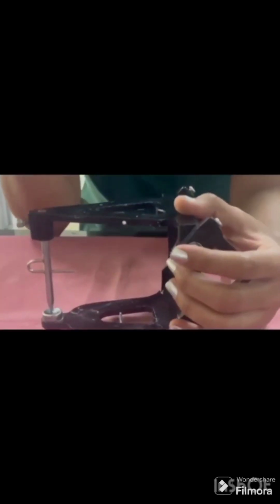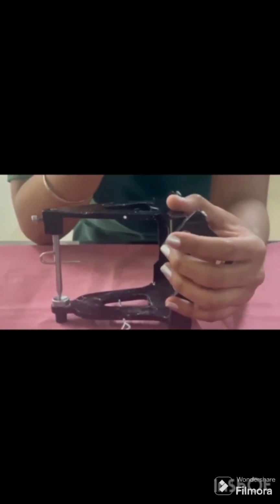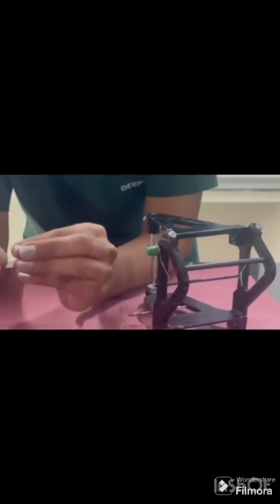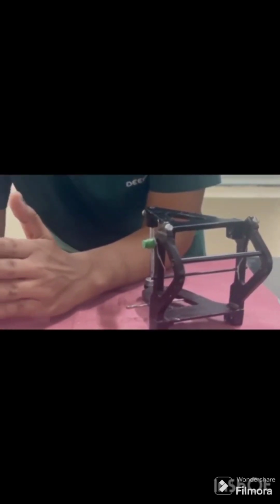Coming to the classification of the articulators, based on adjustability, it is classified as non-adjustable articulator, semi-adjustable articulator and fully adjustable articulator. A non-adjustable articulator does not allow adjustment to replicate any mandibular movements. Examples include class 1 and class 2 articulators. A semi-adjustable articulator allows adjustment to replicate average mandibular movements, which includes class 3 articulators. A fully adjustable articulator allows replication of three-dimensional movement of the recorded mandibular motion, which includes class 4 articulators.